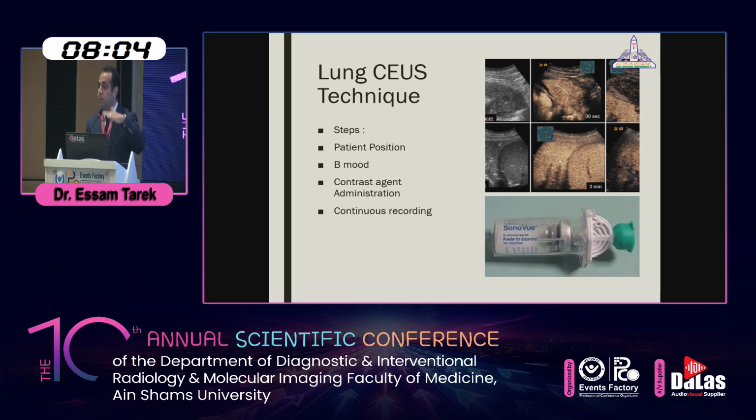Then the next step will be administration of contrast media. The contrast media we usually use is SonoVue, which is a sulfur hexafluoride material, which is a microbubble. This microbubble is just a gas, so it just goes to the microvasculature, and will be inhaled and exhaled by the lung. So if we have a patient with impaired renal function, I think this is a very good substitute for contrast CT. But it only depends on the availability of this contrast again.